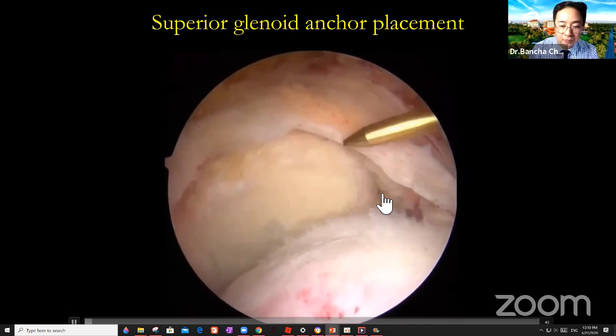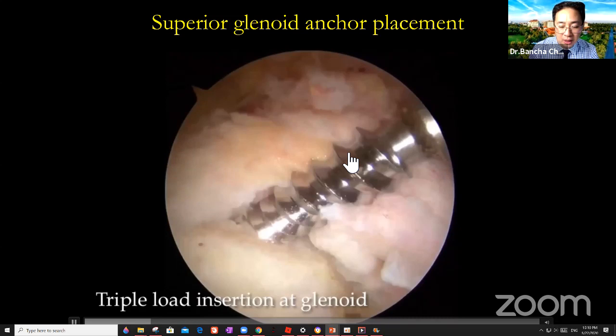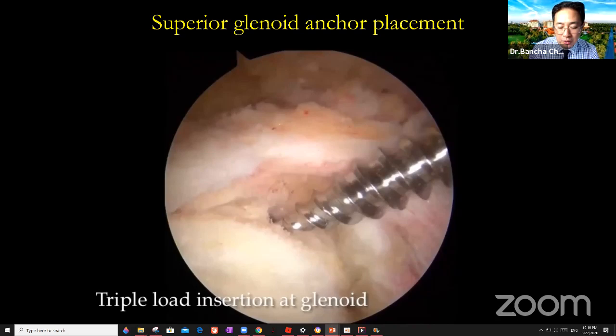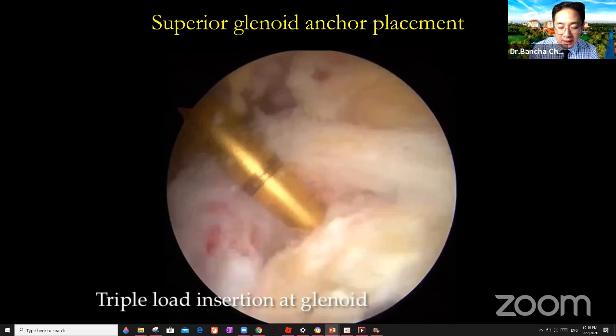After that, we put the anchors on the glenoid. Okay. I prefer to use triple load. So we have totally 12 sutures. Tapping: this area of the bone is quite hard, so I always tap. I use two. One in the front and one in the back.